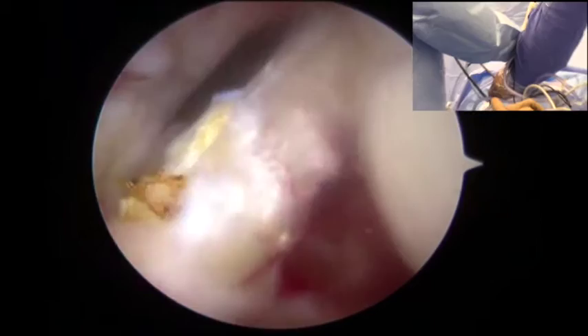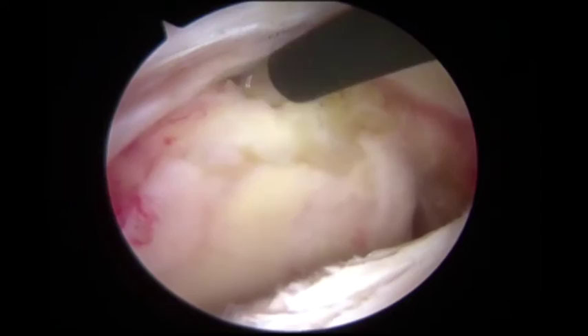The patient was brought to the operating room and placed in the lateral decubitus position. Through an anterosuperior portal, the biceps, which was found to be partially torn, was released. The anterosuperior, posterosuperior, and central portion of the glenoid was then debrided, allowing for observation of the denuded glenoid bone.